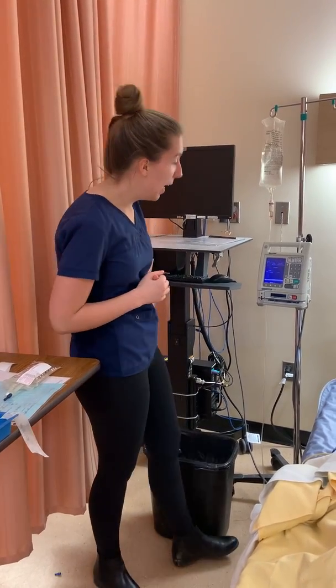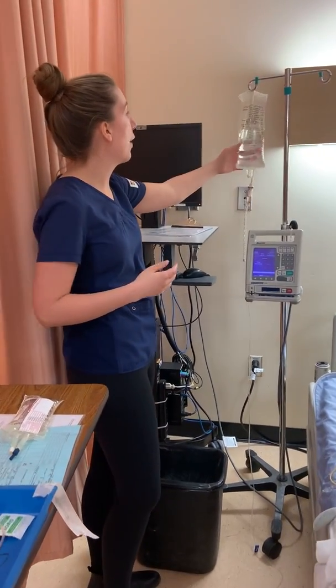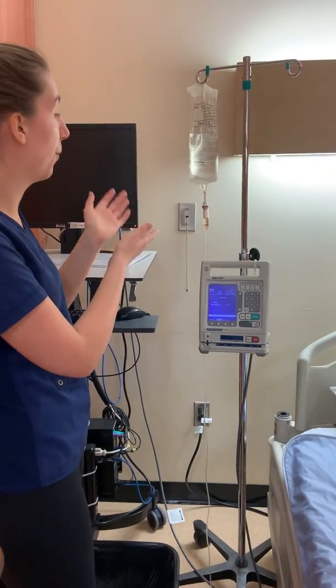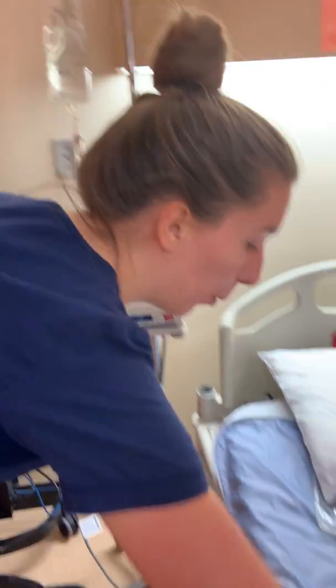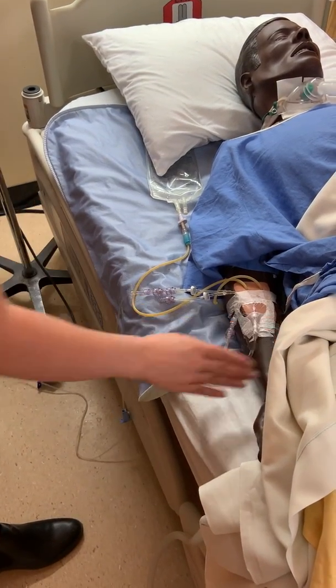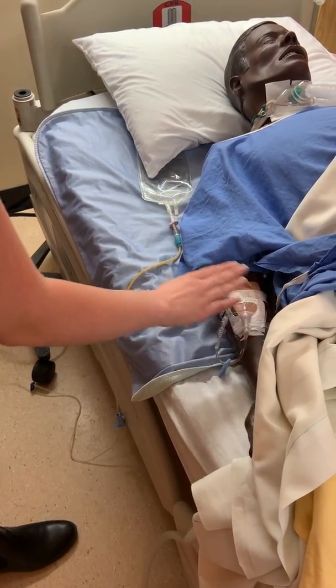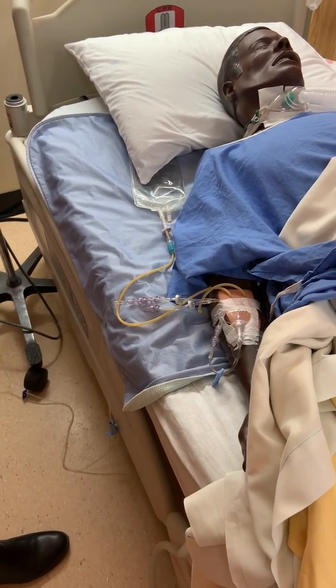So at this point, I'm going to come over to my Baxter pump. Doing my safety check, I can see that I have the appropriate carrier infusing at the right rate of TKVO. I can also see that we have a Y port being used, which I will connect it to. Looking at my patient's IV site, I can see that there's no signs of infiltration or inflammation, no pain upon palpation, and the dressing is dry and intact.